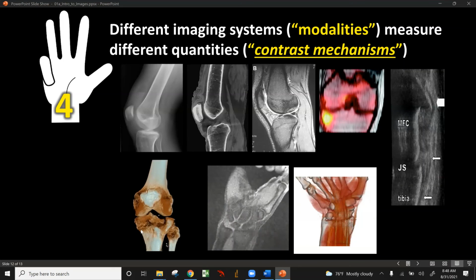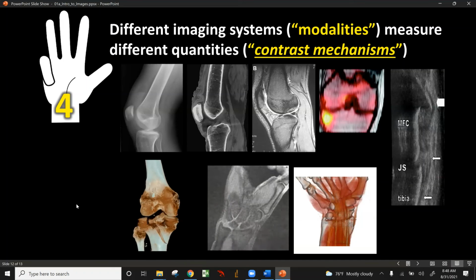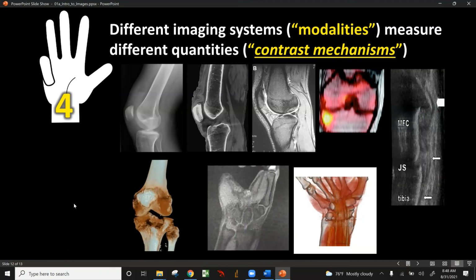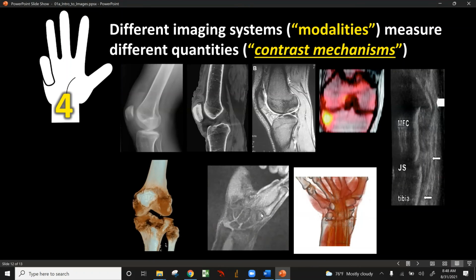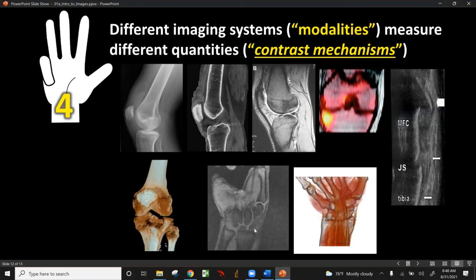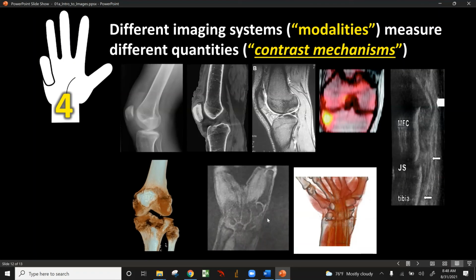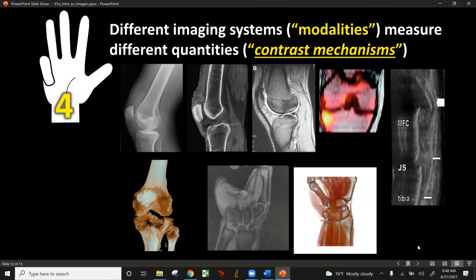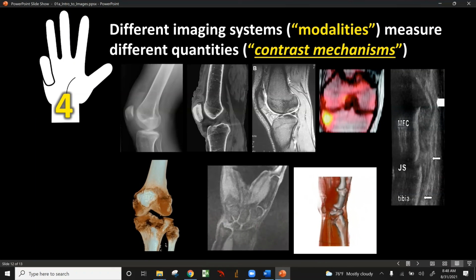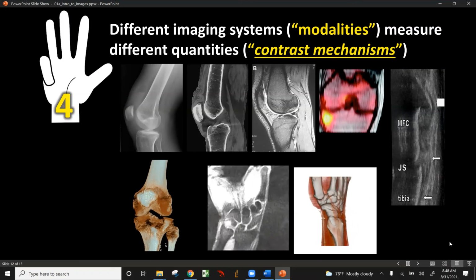You don't have to look at them as slices or projections. You can look at them as volumes, right? This is a volume rendering of a CT image of a knee. We said there are measurements not only in space, but in time. Here is a coronal view of the wrist as it moves in time in MR. Here is something similar in CT. Actually a 4-dimensional image of the wrist. Interesting, all 3 spatial dimensions at each point in time.